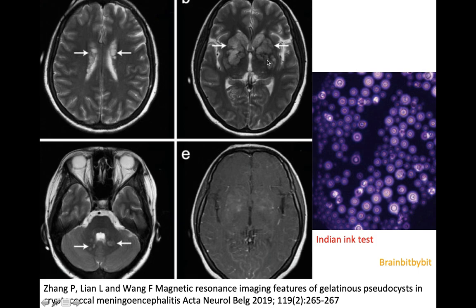As a rule of thumb, normal large perivascular spaces are about three millimeters, and if they're larger, you should think of cryptococcus. The perivascular spaces are also enlarged along the ventricle and in the infratentorial compartments.